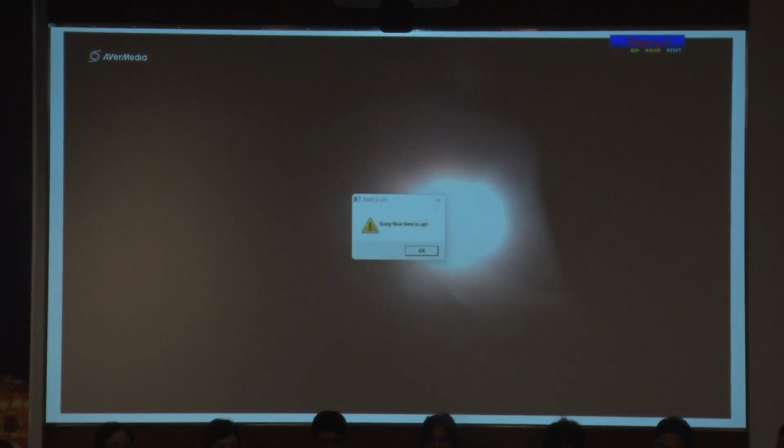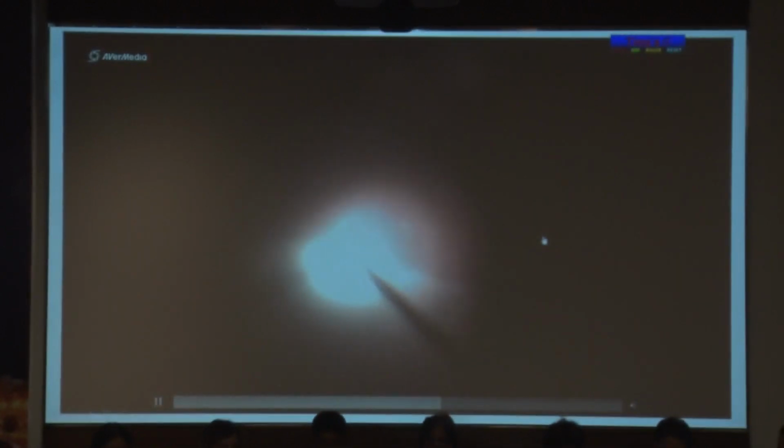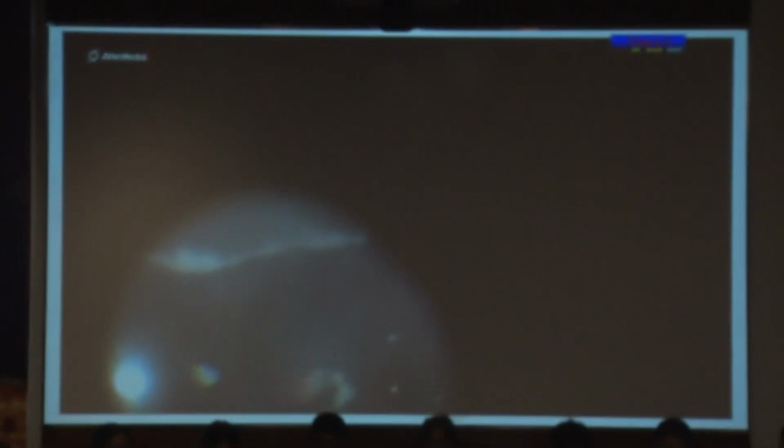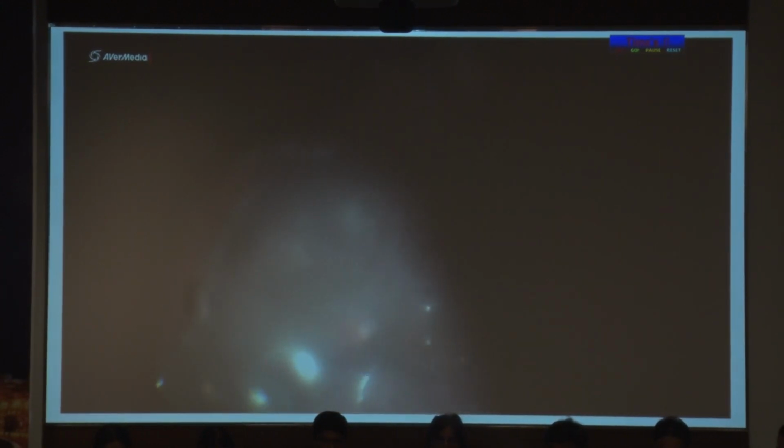The inferior detached retina was folded upon itself to look for submacular pathology, and the blood present in the submacular part was removed with the suction property of the cutter. The detached retina was placed back with PFCL, and some endolaser was performed at the margin of the retina.